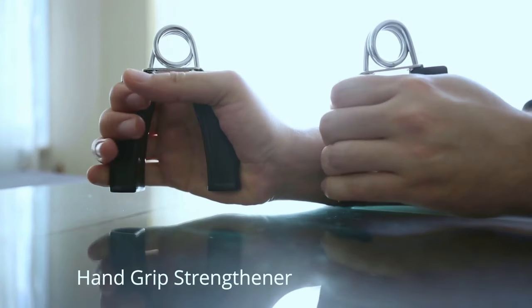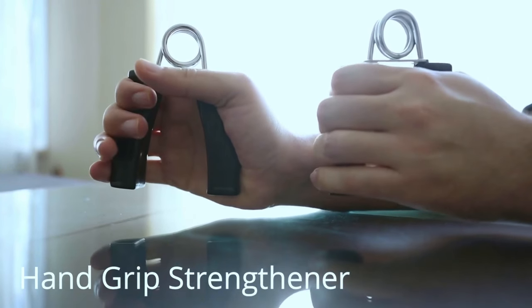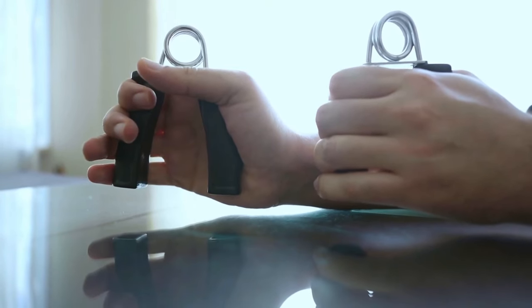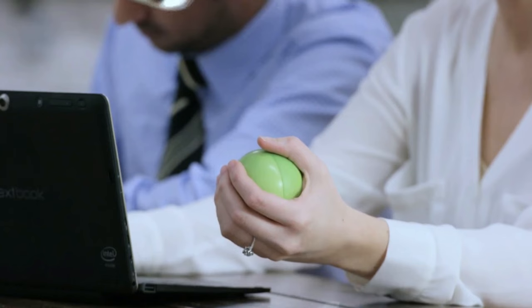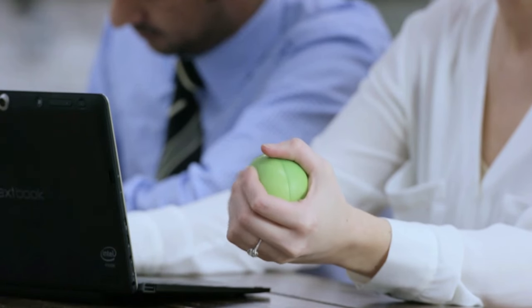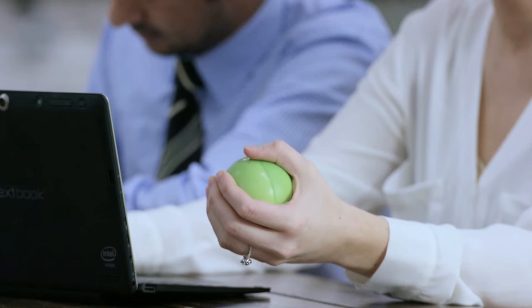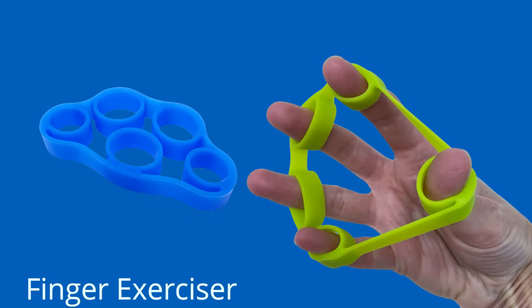Now let me introduce you to these devices. The Hand Grip Strengthener is designed to help people with arthritis build up grip strength. It consists of a spring-loaded mechanism that allows users to exercise their hands by squeezing the device. Practicing these exercises a few times a day — for example, when you watch TV — will help you improve hand strength and reduce your pain.